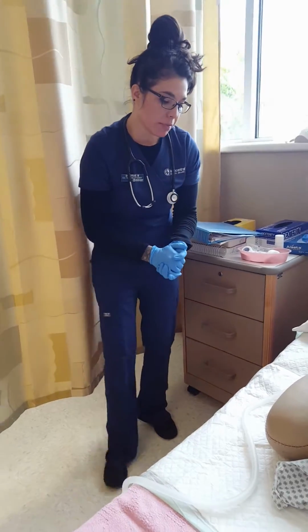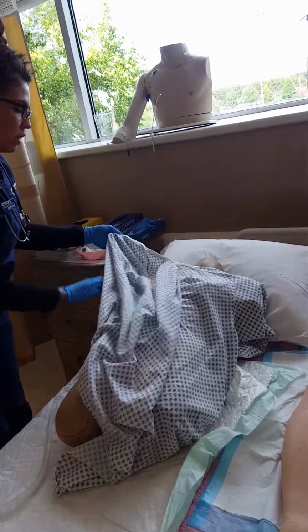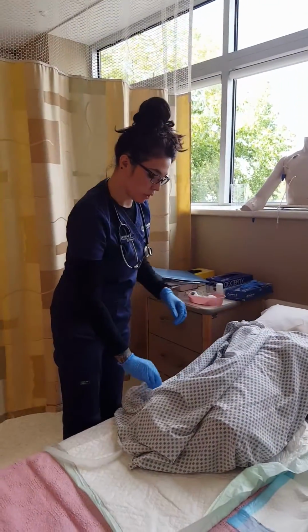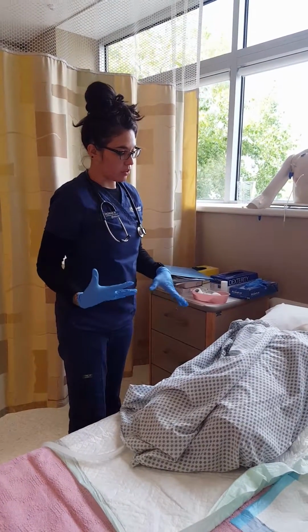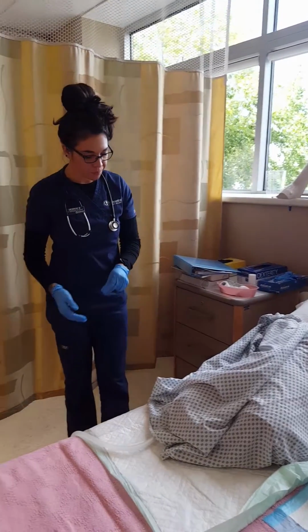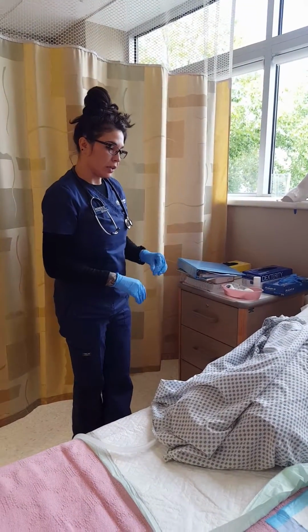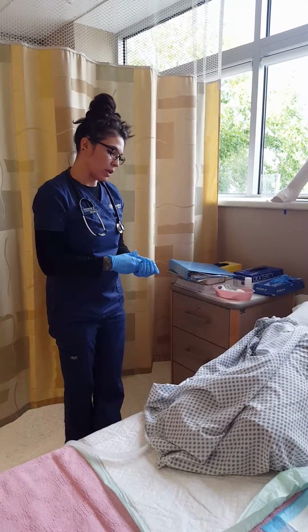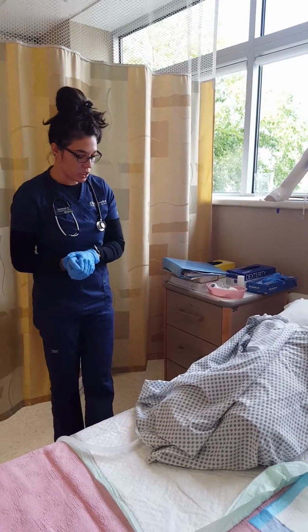So Mr. Smith, every 2 hours, I want you to try to reposition and do some deep breathing and some controlled coughing. We want to expand those lungs to prevent any pneumonia from happening. Keeping the collection device below chest level is extremely important. We don't want any backflow to happen because that could cause some infection.